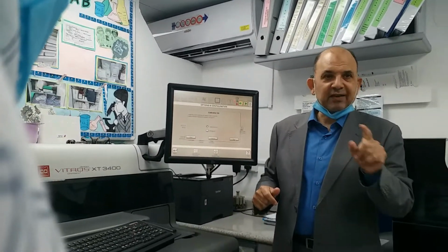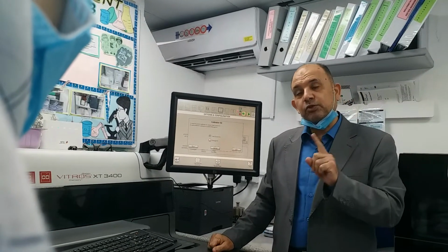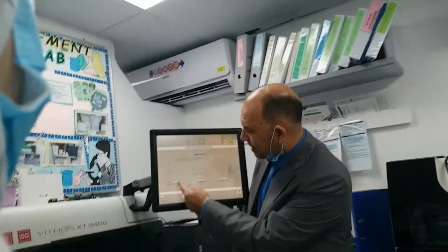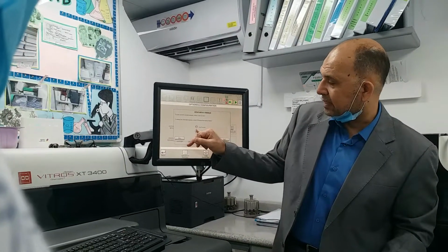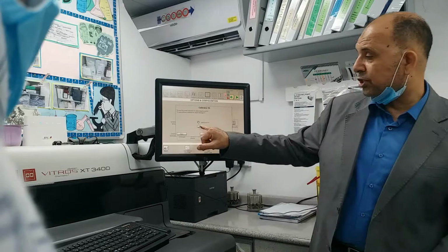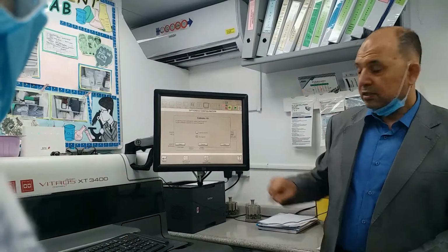For the time being, I have to ask you: are you using Cal 32 for sodium, potassium, chloride, or are you still using Cal 2? We're using 32. In this case, I have to go back a little bit and choose alternative assay, Cal 32. Then I'll say next. Now I want to change it to 2. Okay. Then I'll say next.